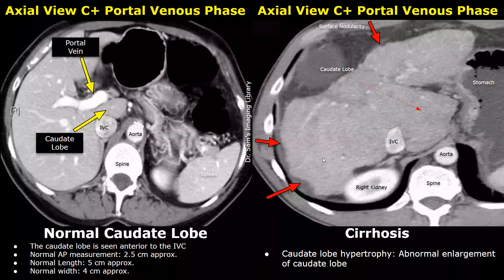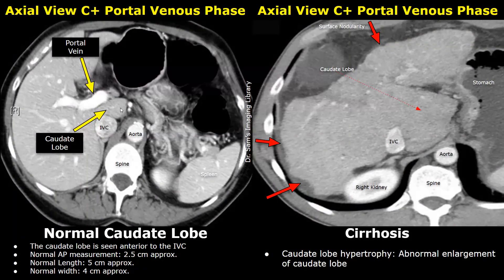These images focus on the caudate lobe. In an axial image, the caudate lobe is seen anterior to the IVC — the inferior vena cava. The normal AP measurement is approximately 2.5 centimeters, the normal length is approximately 5 centimeters, and the normal width is approximately 4 centimeters. In liver cirrhosis the caudate lobe can increase in size. In this image you can see an enlarged caudate lobe compared to the normal appearance. Surface nodularity and ascites are also present.